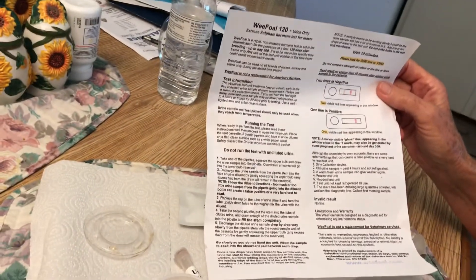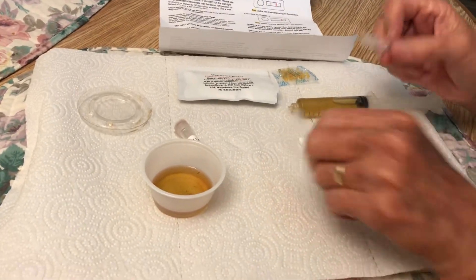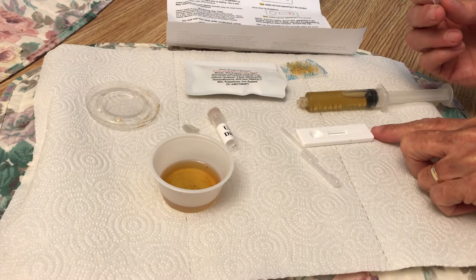I think they make it in New Zealand; I got it from Colorado. This is what comes in it: you have two pipettes, you have a urine dilutant, and you have the little test well.